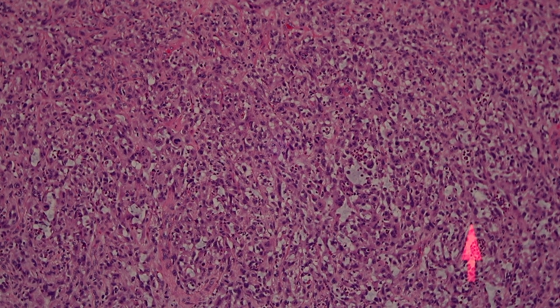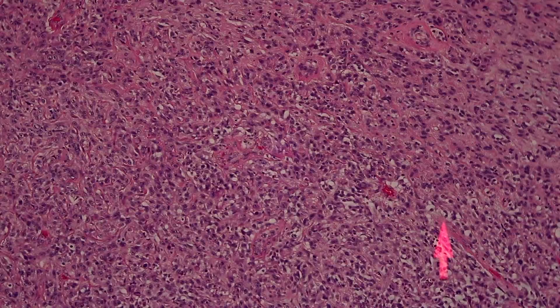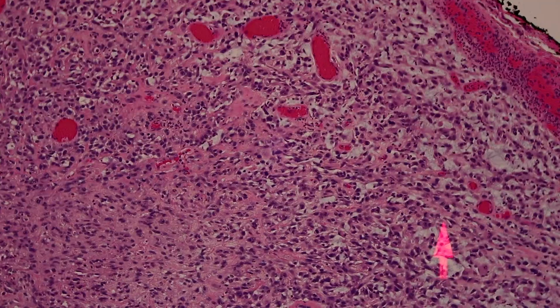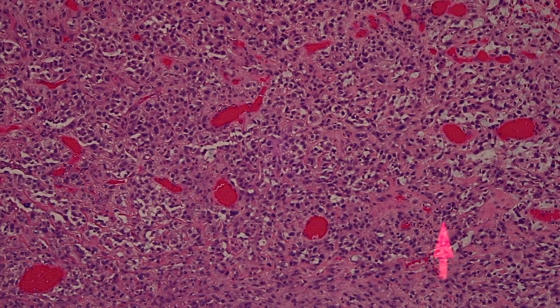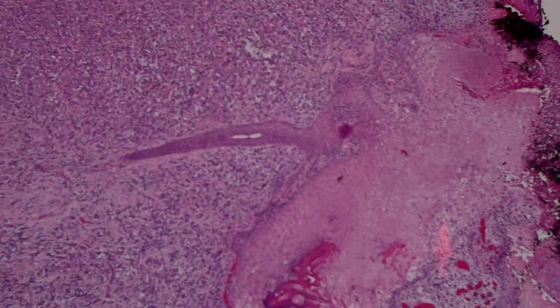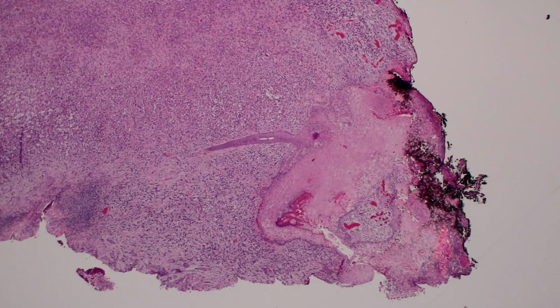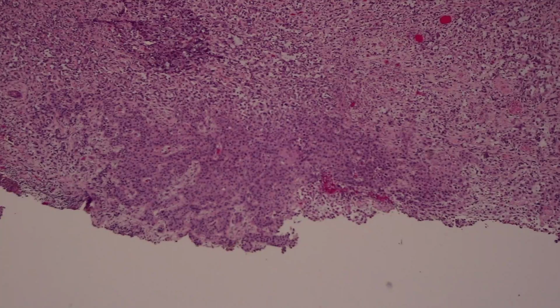Here's an area where you're getting a little bit of that acantholytic pattern. The cells are falling apart, and again, that could be confused for vascular channel formation or other things. So there's a real wide range of features in this particular case. There's round cells and sheets, spindle cells and sheets, a little acantholysis, and then some intact, obvious glassy squamous cell carcinoma here. So this is one that I said was poorly differentiated squame that had spindle cell features, and again, a little bit of that acantholytic pattern where it's falling apart. So just a wide range of patterns that you can see in squamous cell carcinoma.